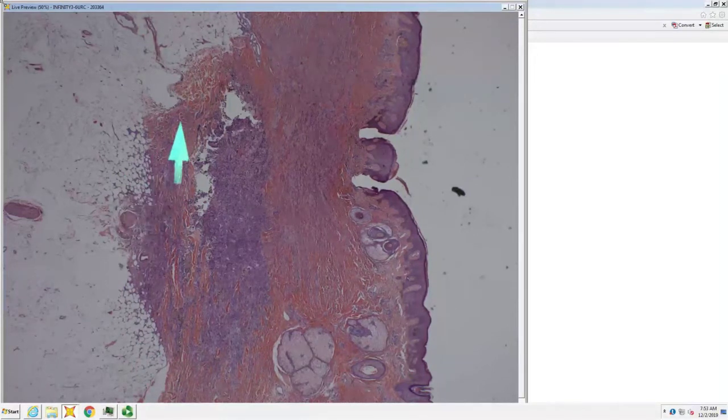You've got collagen balls at the periphery. If you look closer, there are probably black dolphins jumping over those red collagen balls. You have platelike acanthosis, you have follicular or sebaceous induction, it's a dermatofibroma. Hold on.